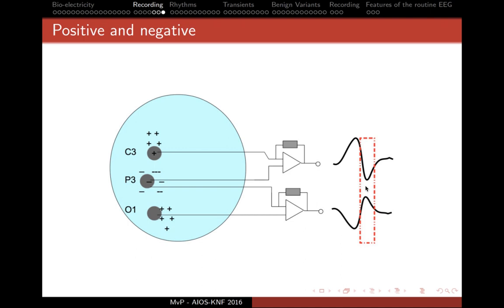And this will become relevant as we will discuss phase opposition, actually negative or positive phase opposition, in relation to the networks that, for instance, generate epileptiform discharges, where we are really interested in where this particular location is approximately in the brain.